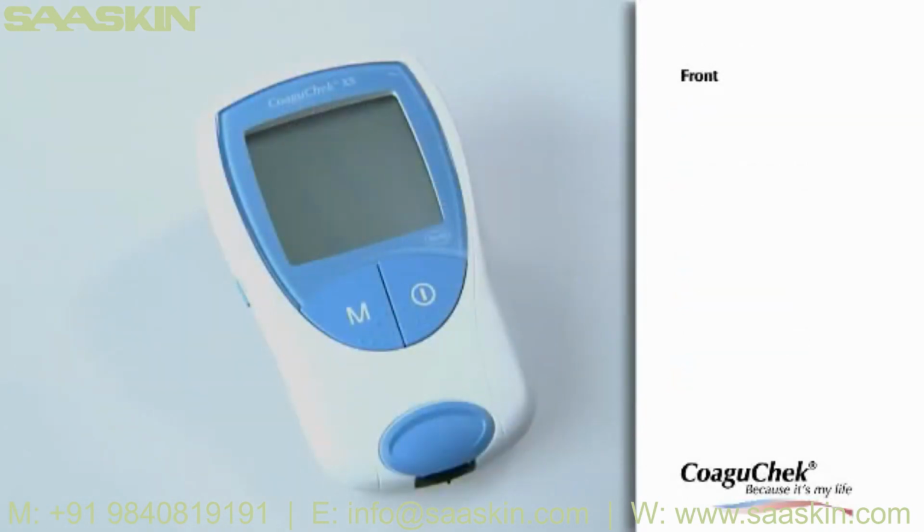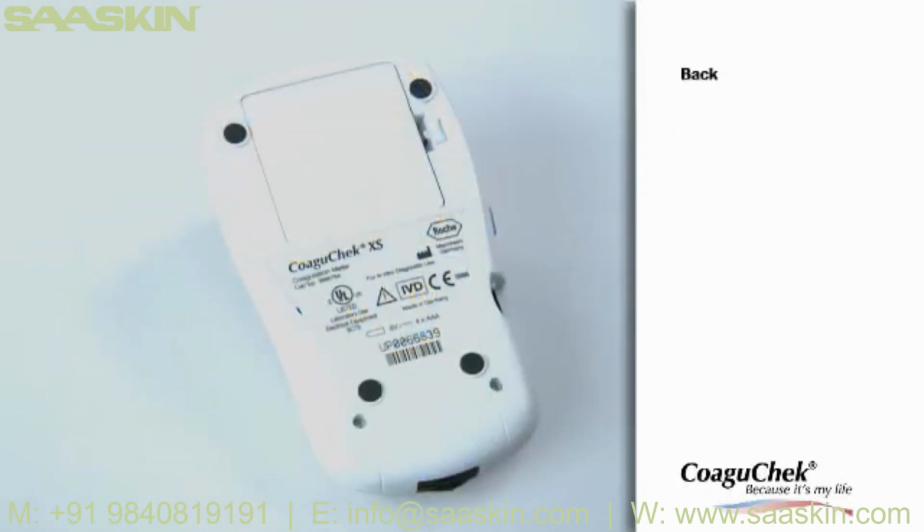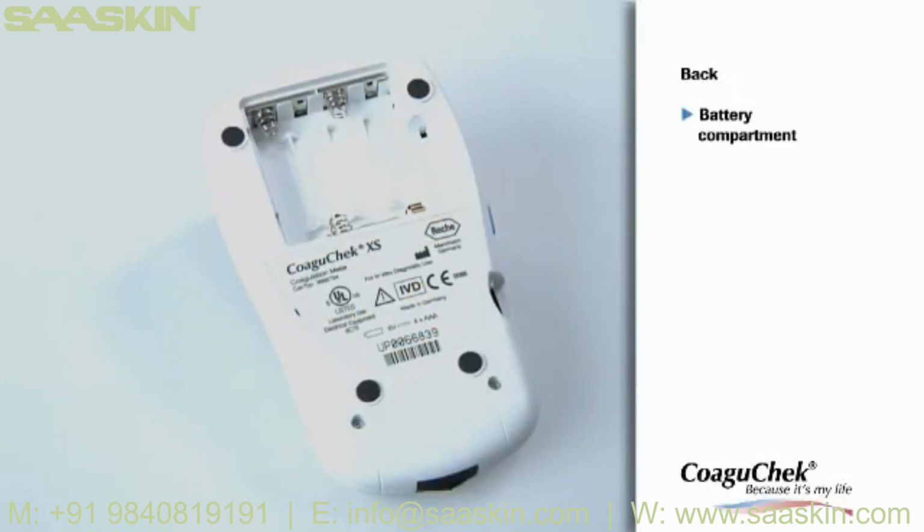Now we will look at the front of the meter. Press the on/off button to turn the meter on or off. Press the M button to view the previous results stored in the memory and to change the meter settings. Press the Set button to enter or change the meter settings.